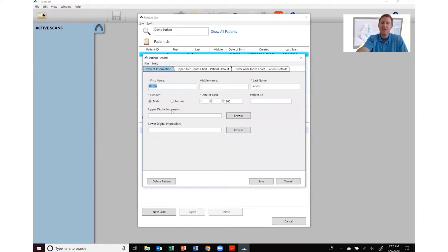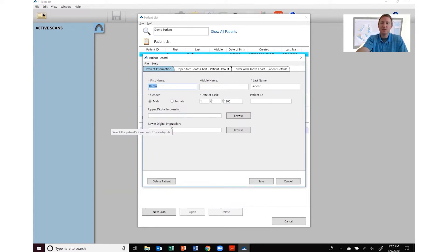As you can see down here at the bottom where it says upper digital impression, lower digital impression, this is where you're going to import your digital impression overlays into your Tscan.